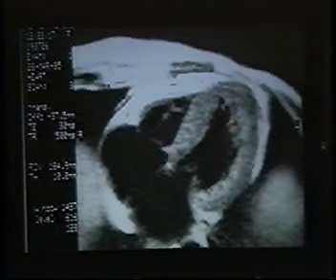And on spin echo images, normally the blood is black because it's flowing rapidly, and the blood that has been stimulated by the RF pulse is somewhere down at the toes by the time you sample and get your image. However, if the blood is flowing slowly, on cardiac gated images you frequently will see signal from the blood during diastole, and then the problem comes up: are we looking at clot or are we looking at slow flowing blood? In some cases, we usually do our studies with 2 echoes.